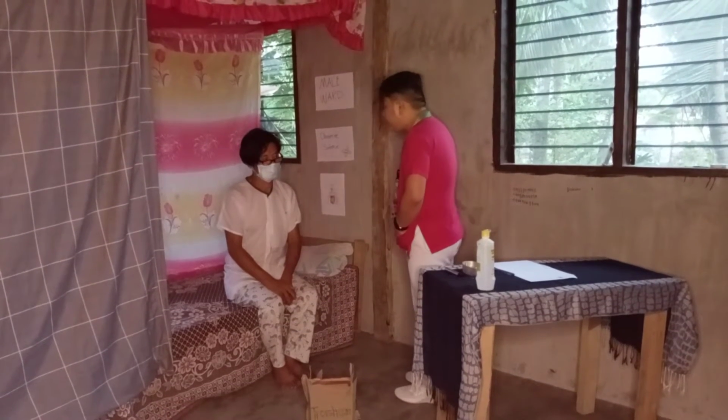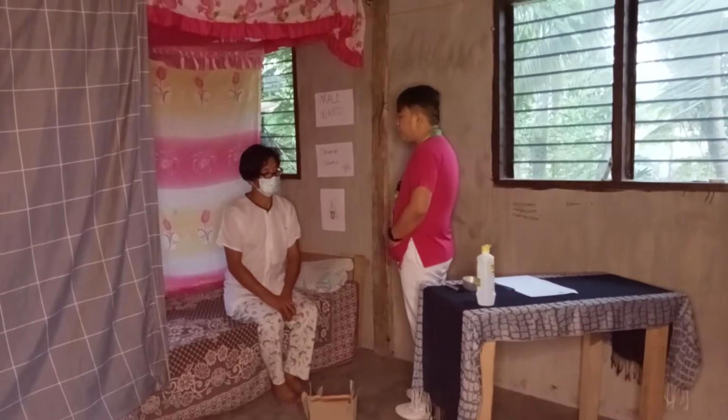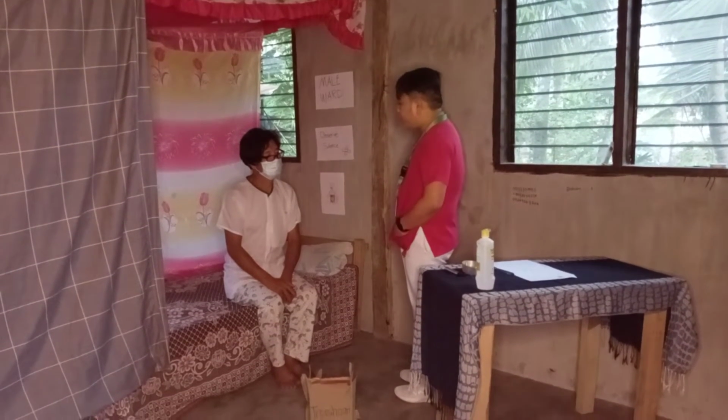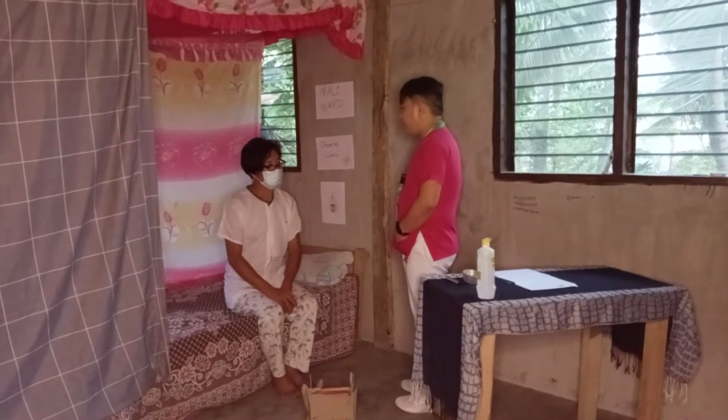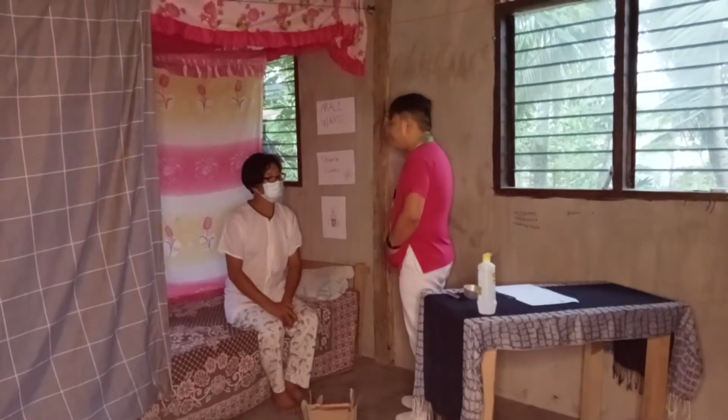Good morning, sir. Ako po si Mohamed Ingawalan, sir, ang nurse niyo sa araw na ito. Maaari po bang malaman ang inyong pangalan? Leo Cano. Okay, so ngayon po, sir, kukunan po kita ng body temperature, ha?